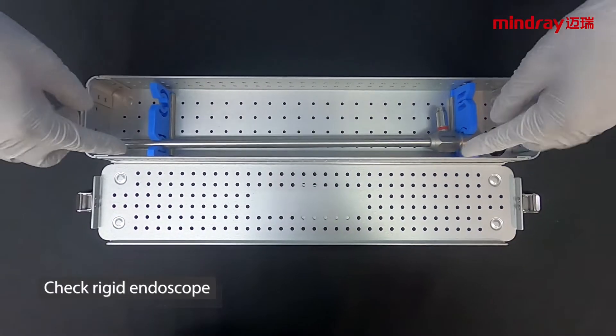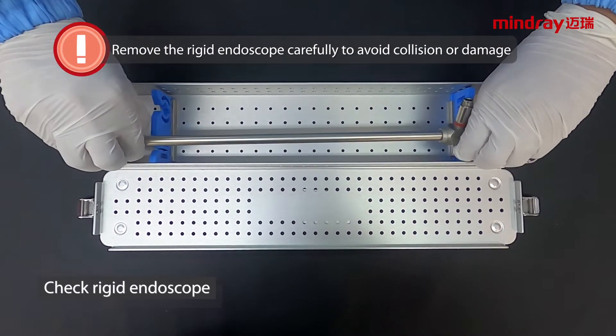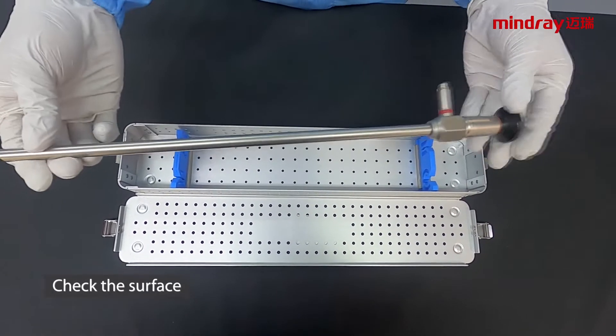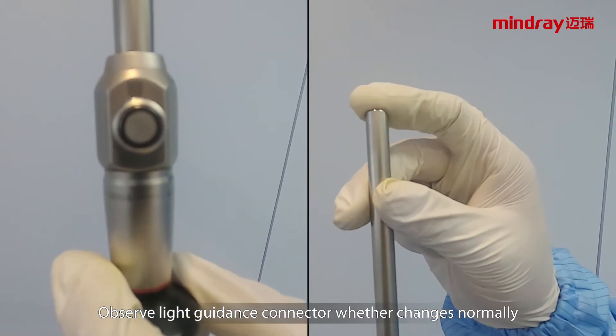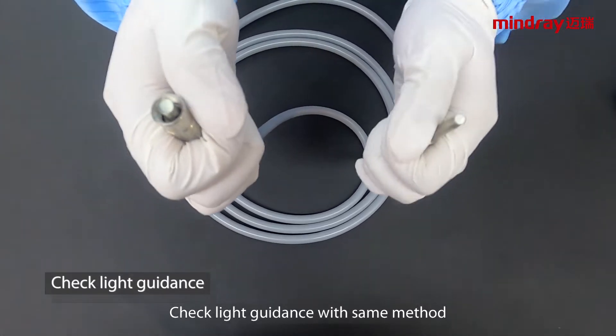Rigid endoscope check: remove the rigid endoscope carefully to avoid collision or damage. Check the surface. Shield the objective end intermittently to check the photopermeability and observe whether the light guidance connector changes normally. Check the light guidance with the same method.